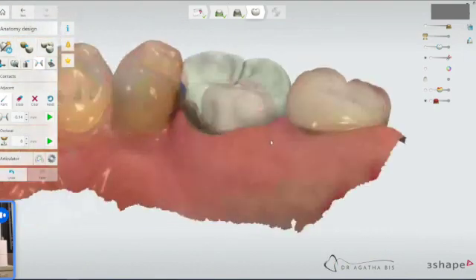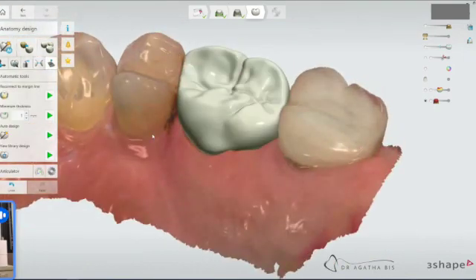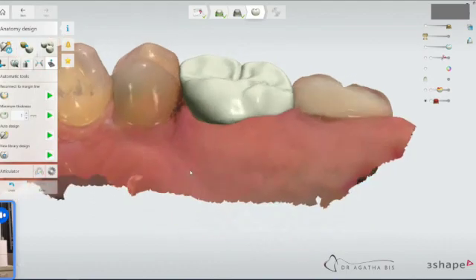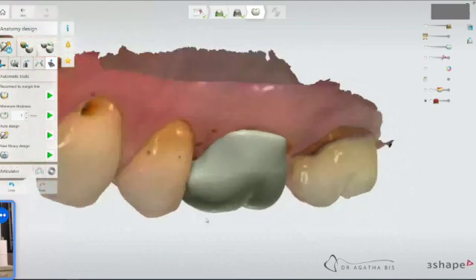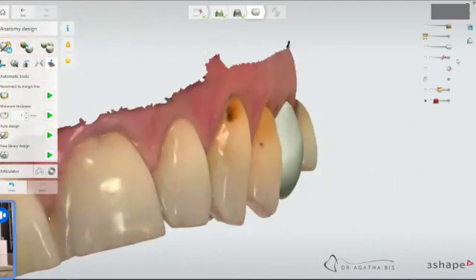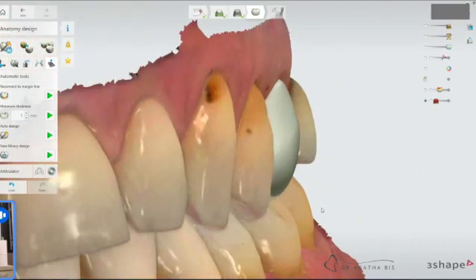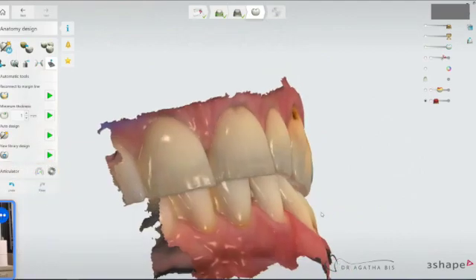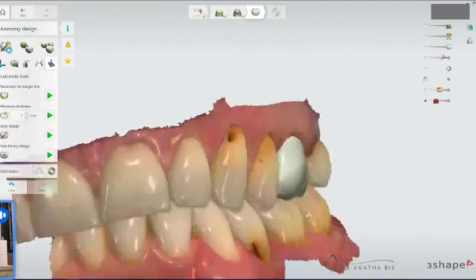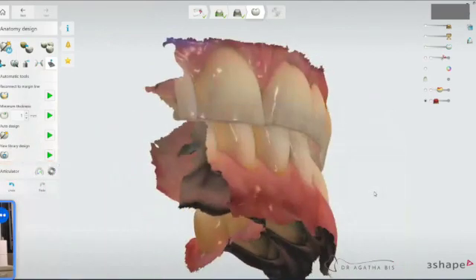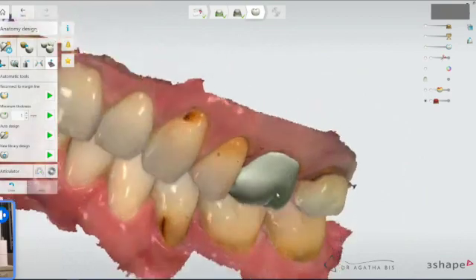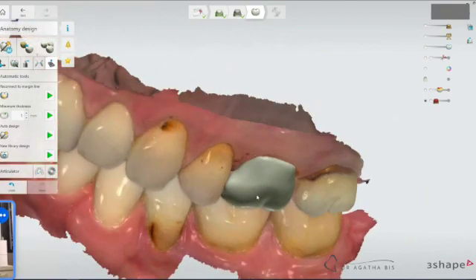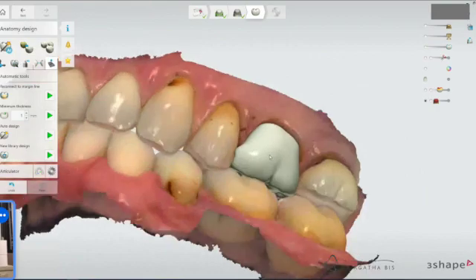Now we're starting to go back to reconnect to margin line, mainly just to pull that contact through all the way to the gum line. The next part is to see if the tooth is properly in line with the opposing and with the arch. Is it flowing? Notice that I just did a quad scan. We don't do full arch for single crowns in general circumstances.